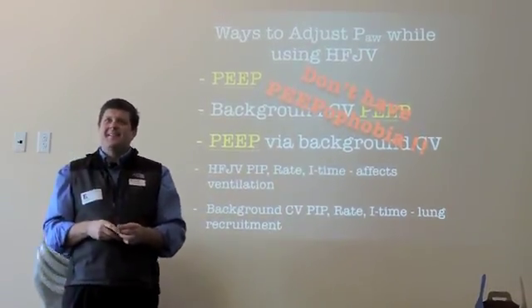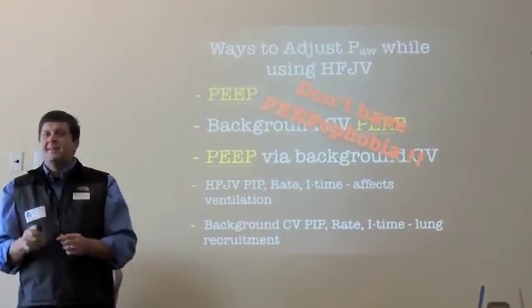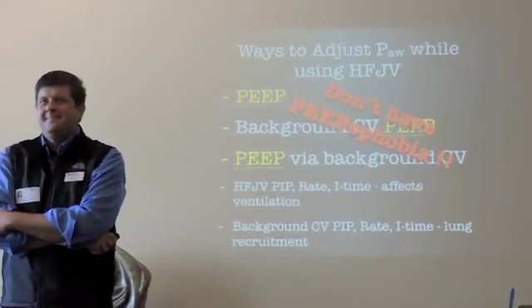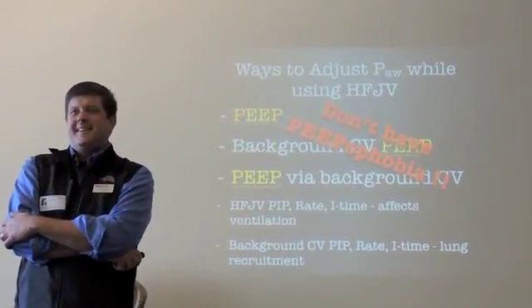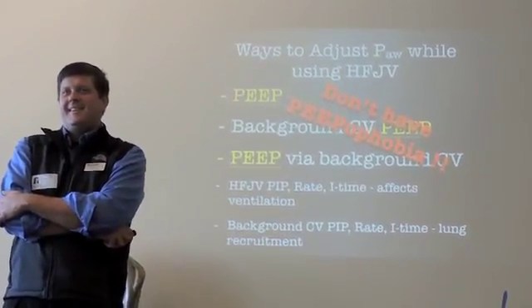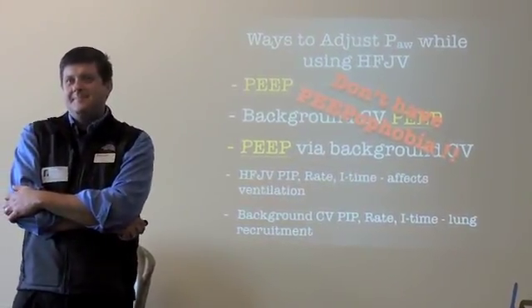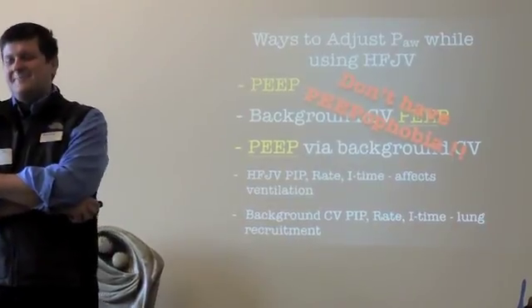The original oscillator actually had the label as PEEP. It did. And when they started using it, there wasn't a doctor that would actually take the oscillator and put it on a patient. So they took it back to the factory, changed the sign to mean airway pressure, everybody was happy. They did.